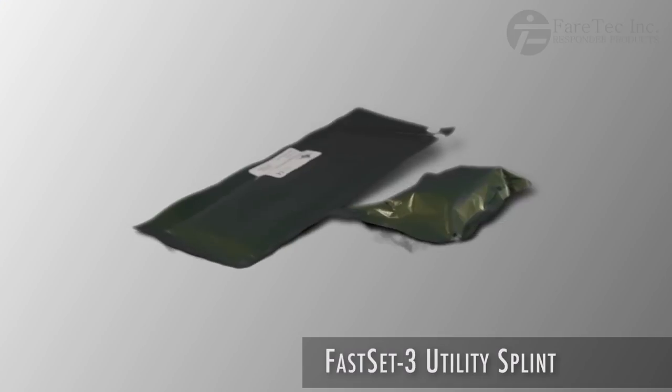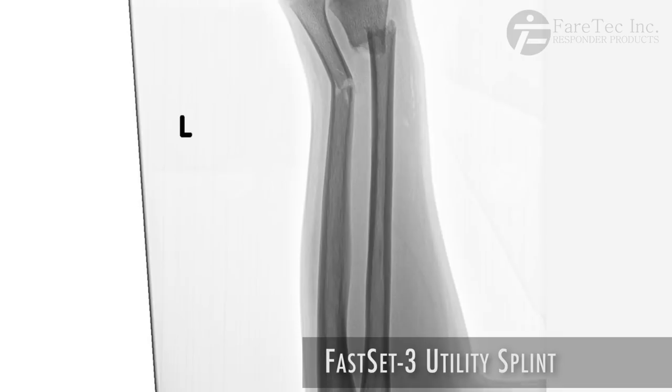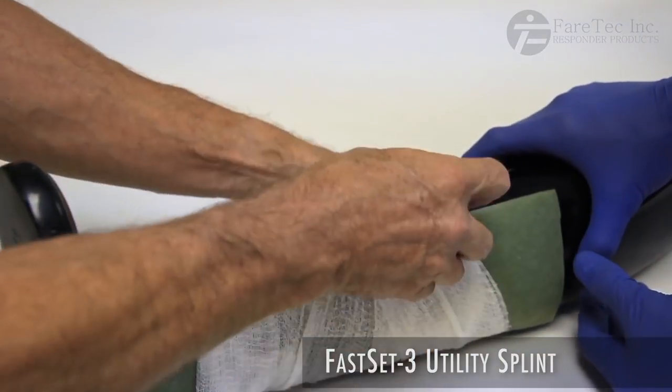The FS3 is available in several sizes. A small FS3 can treat a pediatric forearm, while an extra large could be used on an adult leg fracture.